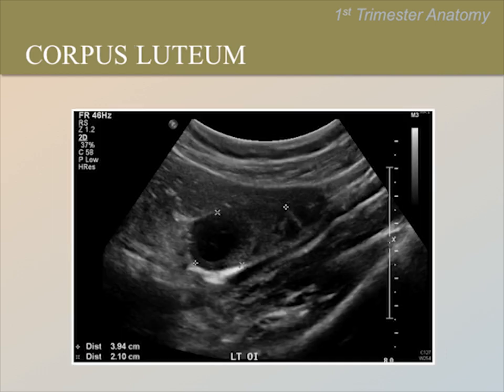Here is another corpus luteum. Can you see the ovary and corpus luteum? Please pause the video now to give everyone time to discuss in the group. Here we have labeled the corpus luteum and outlined the ovary to make them more obvious.